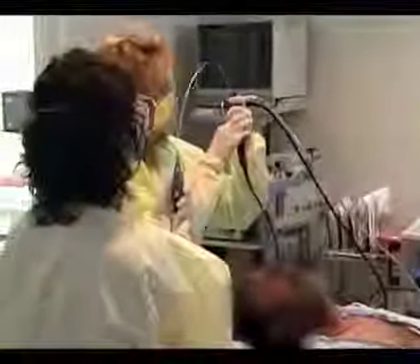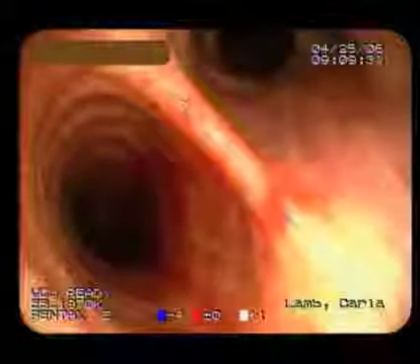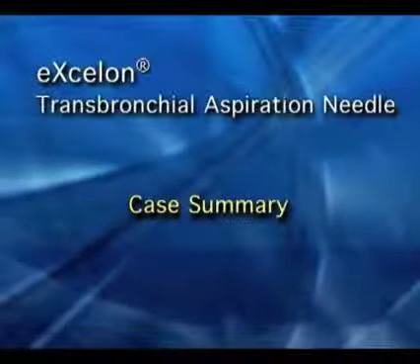And again, my main carina, coming down medial to the main carina, and then pushing against the mucosal lesion. I see a nice entry into the mucosa here, and I'm just agitating with suction. Okay, needle in. Okay, and then we'll do a final inspection of the areas biopsied. Hemostasis has been achieved, and then we've completed the procedure.